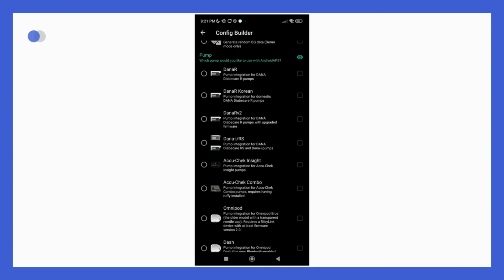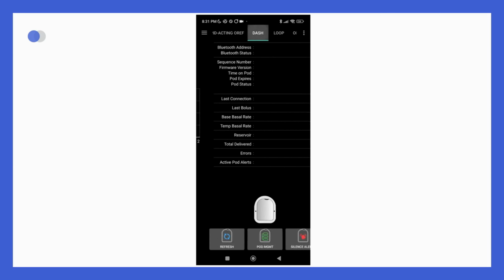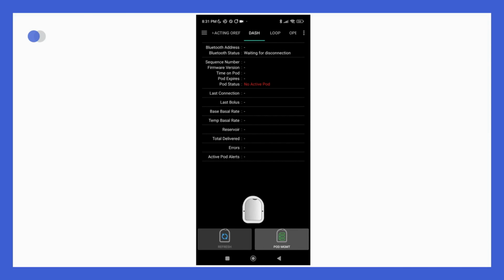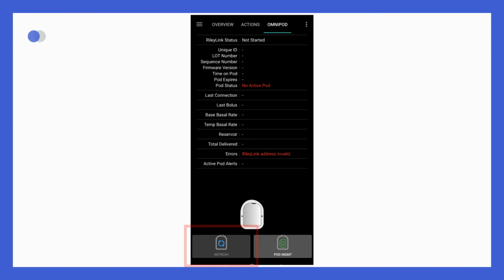You can also change this setting later through the configurator. If you have chosen the Omnipod Dash as your pump type, you will see a dedicated Dash tab at the top of the app interface. In this tab, you can access information about your Omnipod Dash pump and control its functions. The refresh button allows AndroidAPS to establish a connection with the Omnipod and retrieve its status. This can be helpful in disabling certain Omnipod alarms.